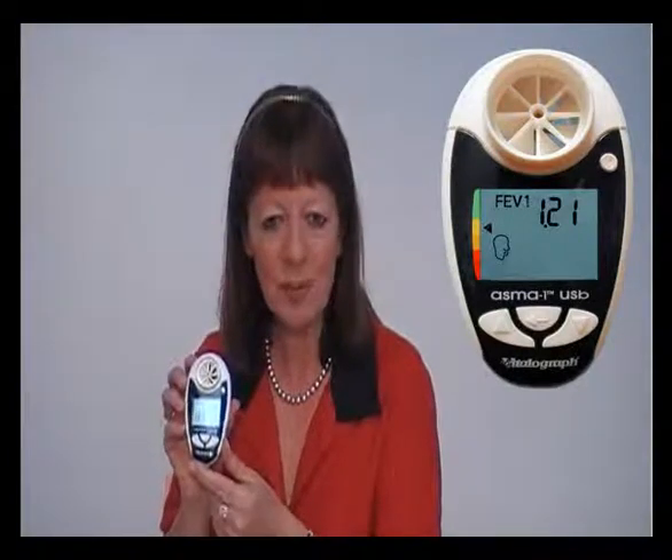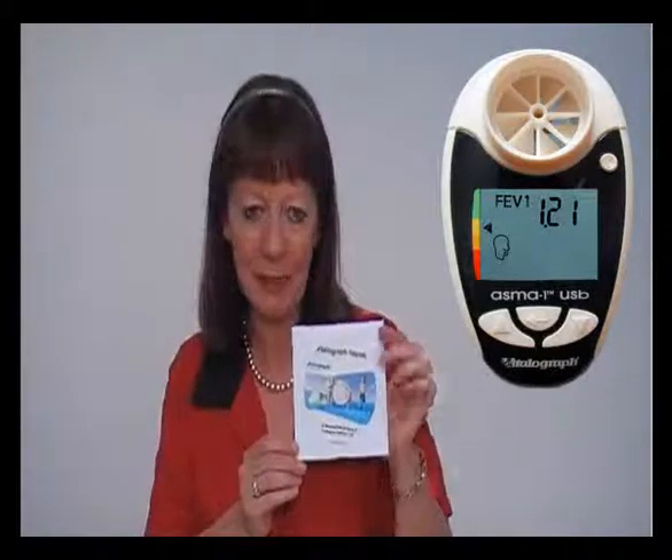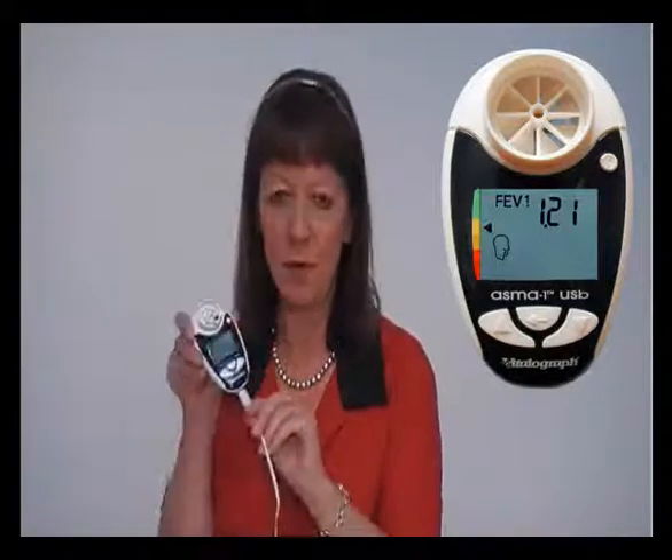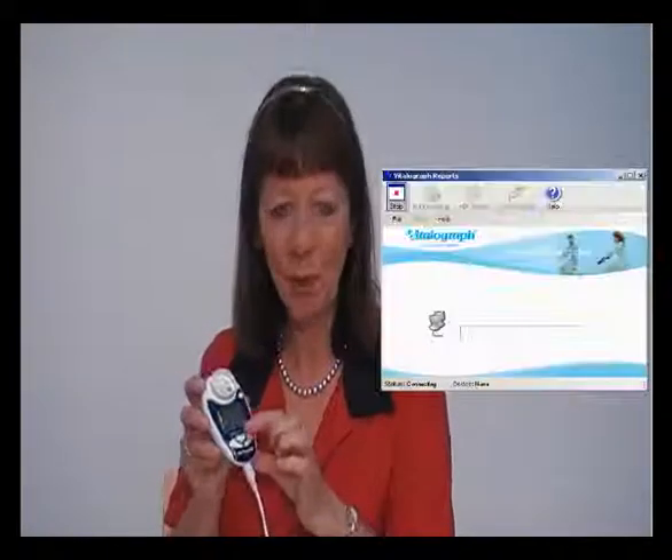If you have a USB version of the AsthmaOne, you will be able to download the data to your computer using the USB cable supplied with the product. You will also have Vitellagraph Report software supplied and loaded onto your PC. Simply attach the cable to the USB port of your PC and the other end of the cable to the base of the AsthmaOne device. Using the circular button, switch the AsthmaOne device on and look for the transmit icon. With this icon showing and Vitellagraph Report software running on your PC, just press the enter button on the unit and the test results will automatically transmit.